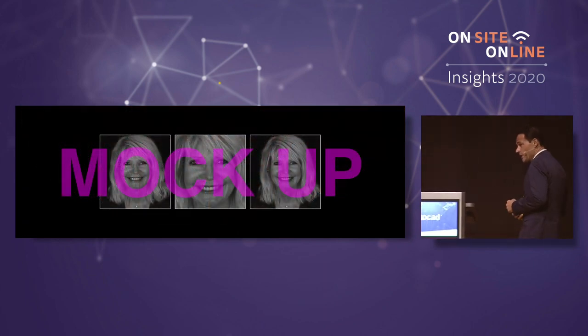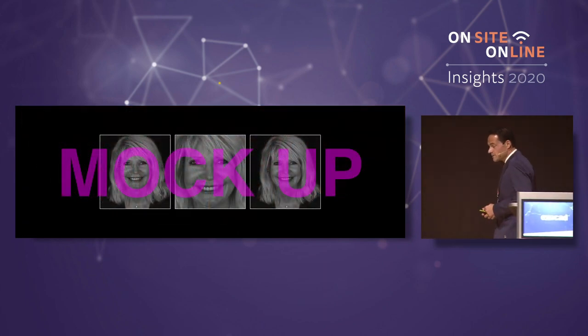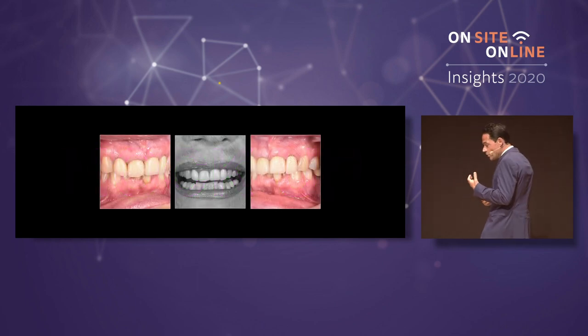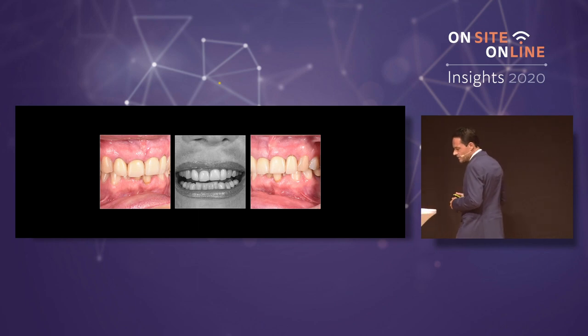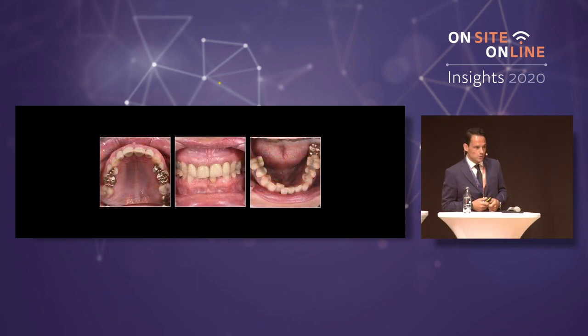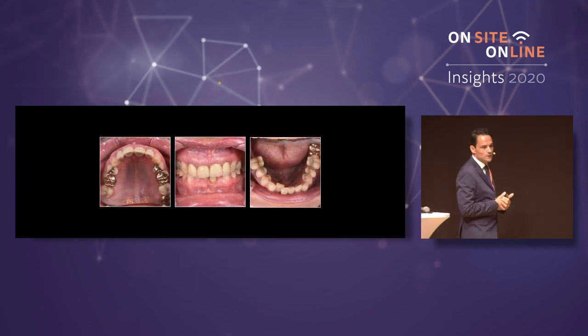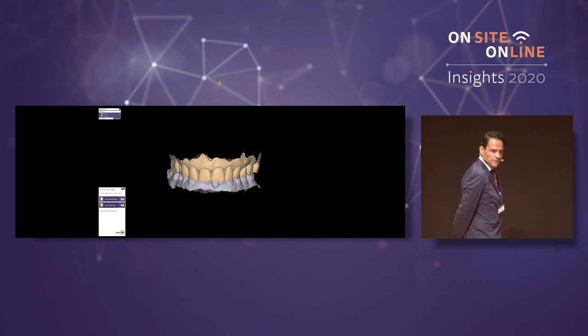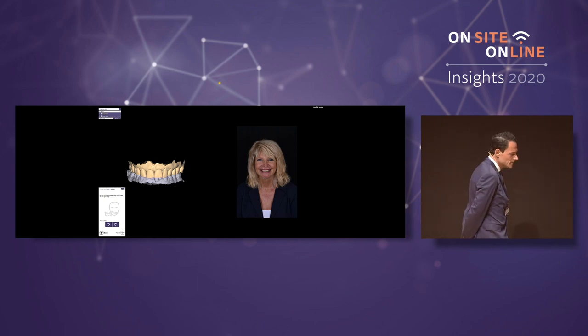I would like to show you another patient. She's from Germany. She came to one of our dental clinics in Barcelona because she wants to remove all her anterior crowns and work in the posteriors, changing these old gold onlays. With one single photography is enough. Sometimes I do not need more.